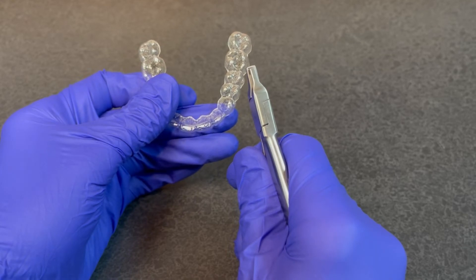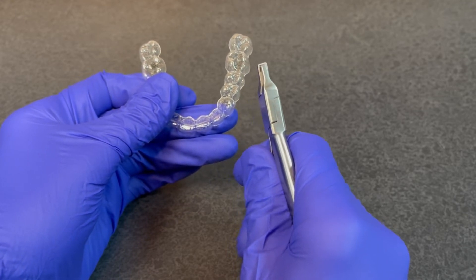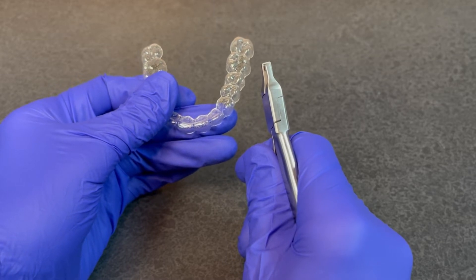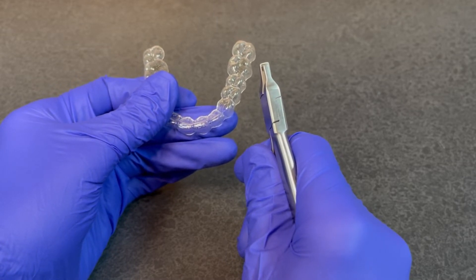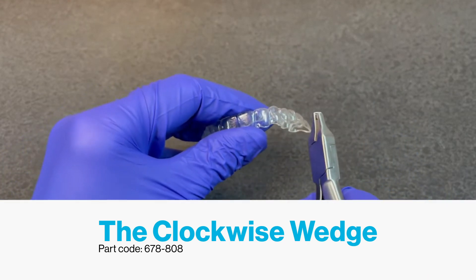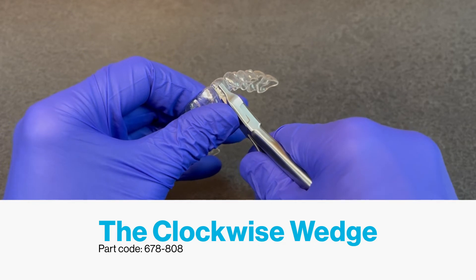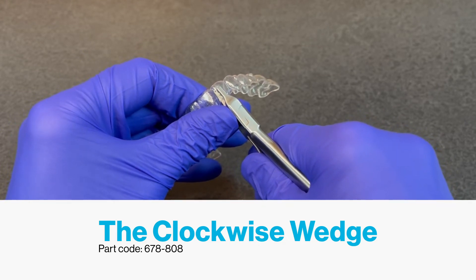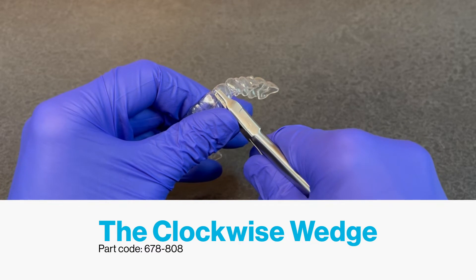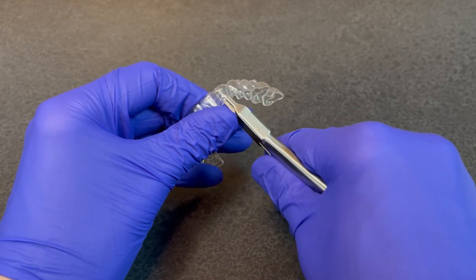In this instance, we're going to focus on the maxillary right lateral incisor, and our intent is to produce a mesial or clockwise rotation, so we'll select the clockwise wedge. The appropriate indent is going to be placed at the mesial line angle of the lateral incisor, and it only takes a gentle squeeze near that embrasure space to produce the desired indent.